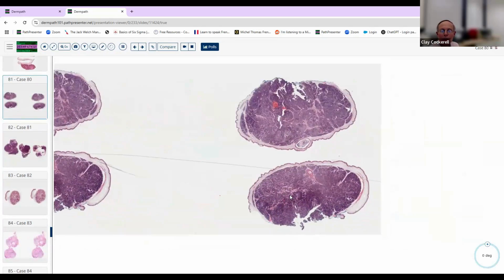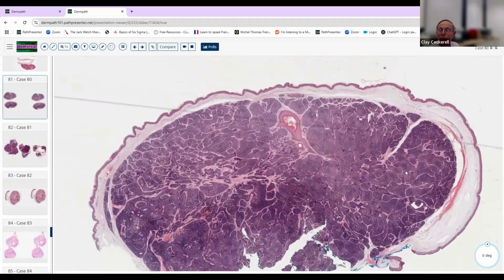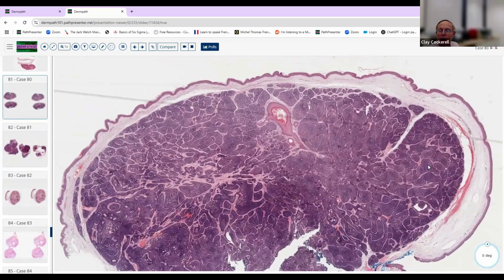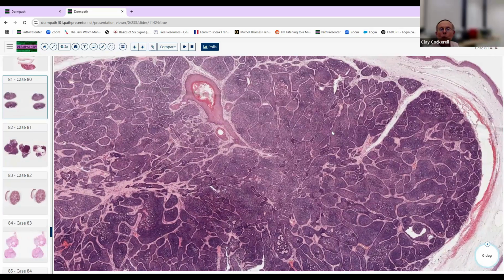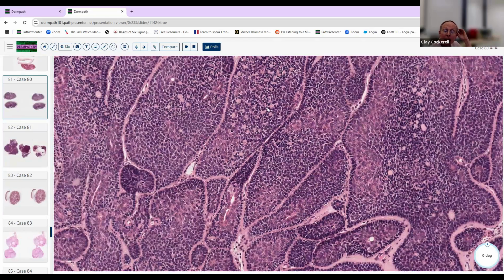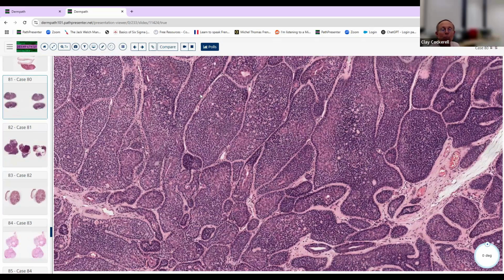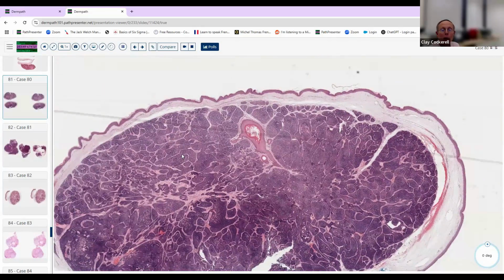Number 80, a lesion with basaloid differentiation. Nice example of the little cylinders of cells with the pink hyaline rims surrounding them. Beautiful example of a cylindroma. Okay, now sometimes you'll see a cylindroma plus a spiroadenoma together. That's more commonly seen in Brooke-Spiegler syndrome. Again, the nice example of the rims of the pink material surrounding all these. Turban tumor, cylindroma.